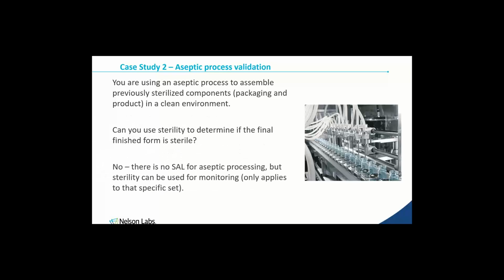Well, no, because there's no SAL being demonstrated for aseptic processing on that finished product. It's all the other validations leading into it. It's all the work going ahead of time into that. So am I going to do sterility testing? Yes, that's part of what USP prescribes. Right. So, I follow what USP says, and I have those other validations with it. And the key is that final validation on that final product isn't showing my SAL. It's not showing that claim of sterility.